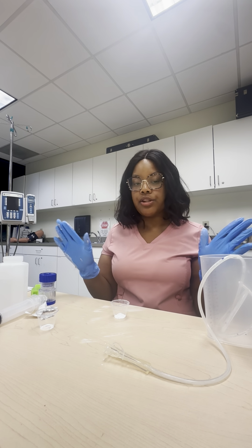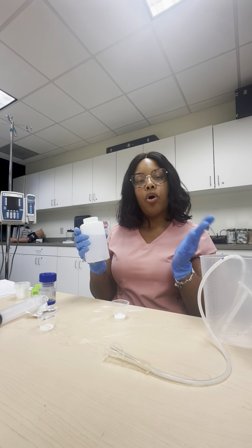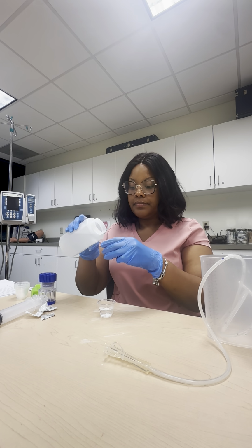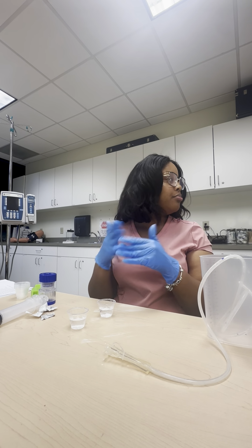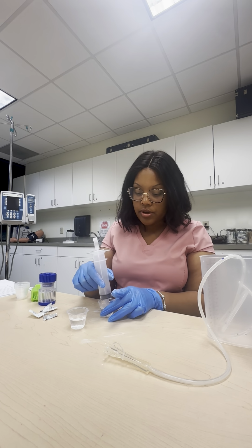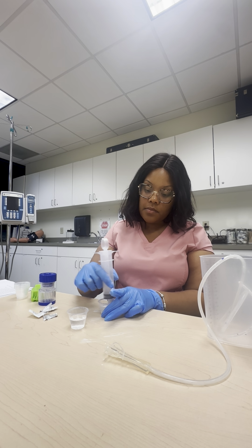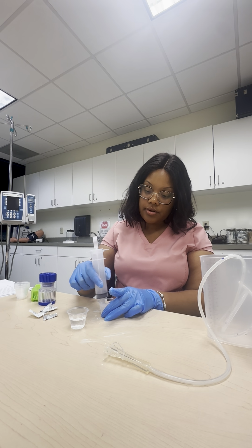All right, so now we're ready to dilute our medication. So we have some warm water right here, and the warm water will just help dissolve the medication. So you don't need a lot, just enough to dissolve it. All right, so if you're like me and you forgot to bring a spoon or something to mix your medication with it, you can always use your little piston syringe. And you just want to take it and stir. Stir, stir, stir.